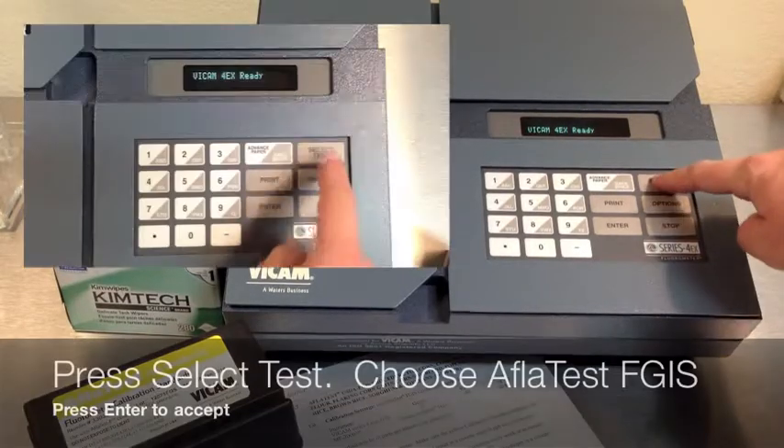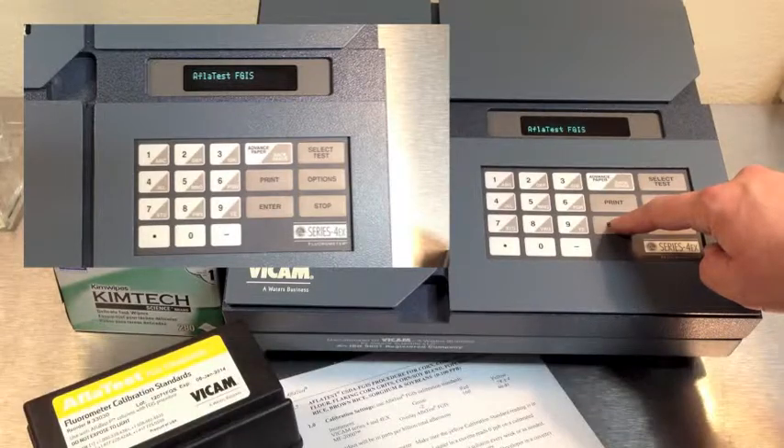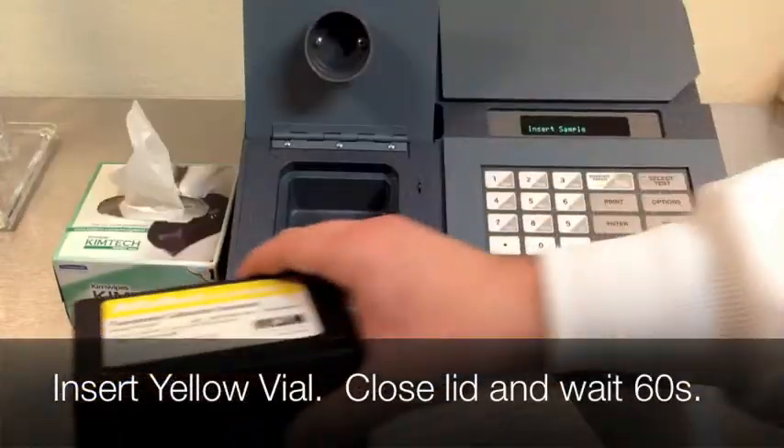Select test, choose AFLITEST FGIS and press enter to accept. Now insert the yellow vial.